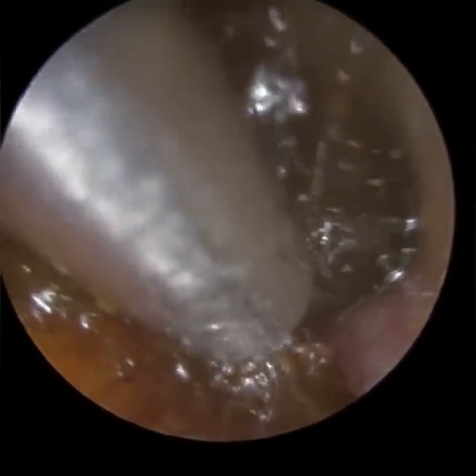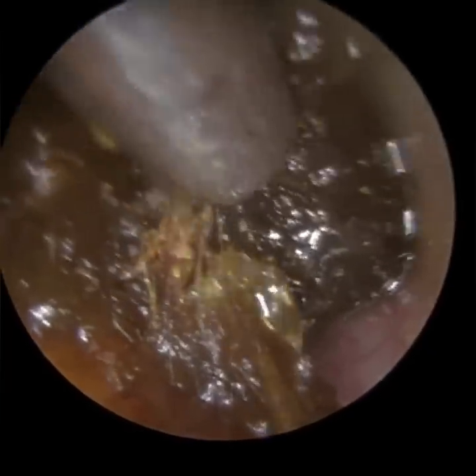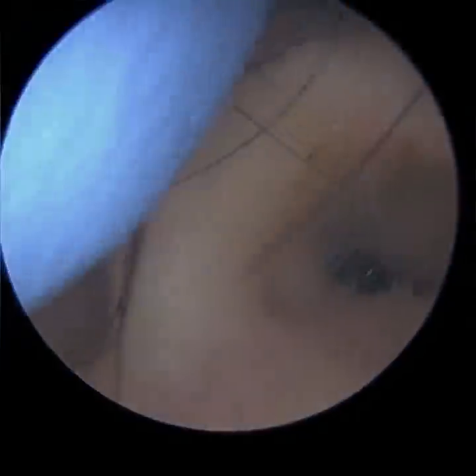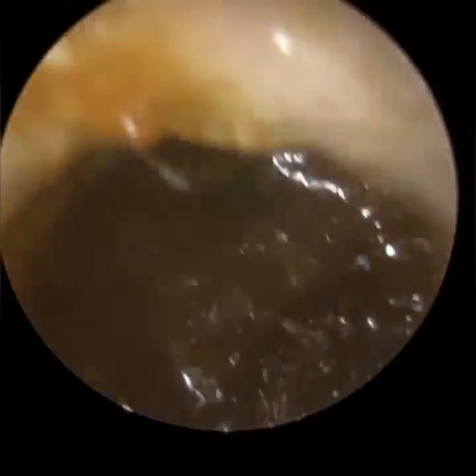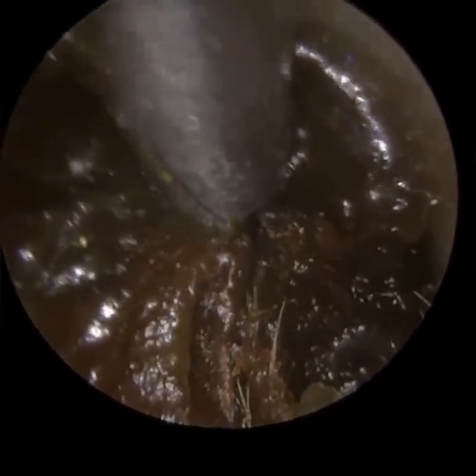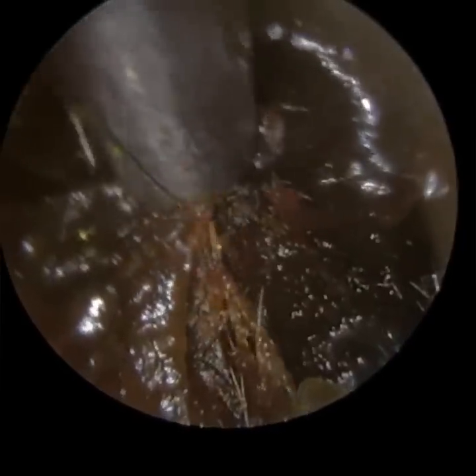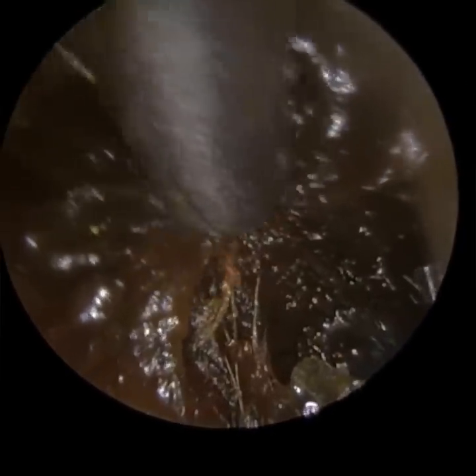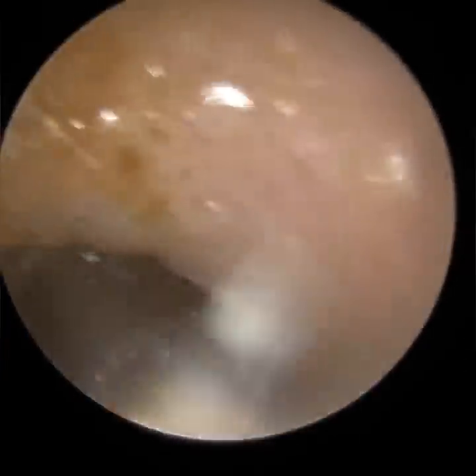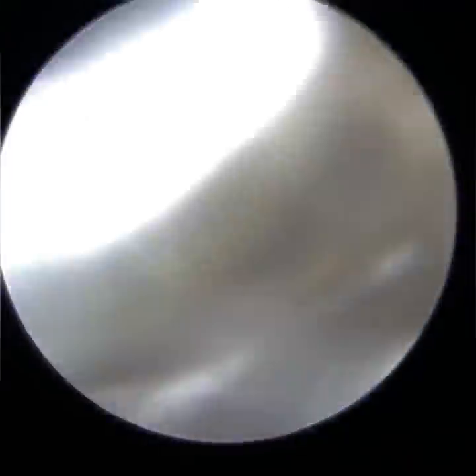I've just instilled some olive oil medical grade spray to help bind this wax together. The patient did use a bit of hydrogen peroxide drops, and it's just made the wax almost a swamp consistency. The olive oil helps to bind it together. I'm just slowly working it away around the edge to separate it. It's just blocked the tube, so I've put some more olive oil spray in, and now I'm going to suction some of the excess oil out.